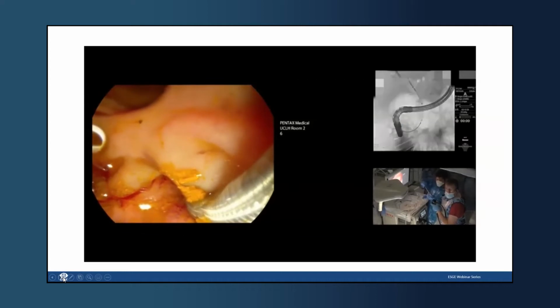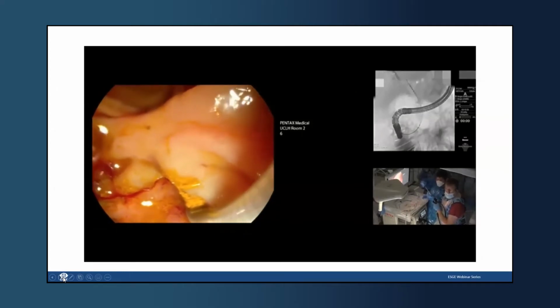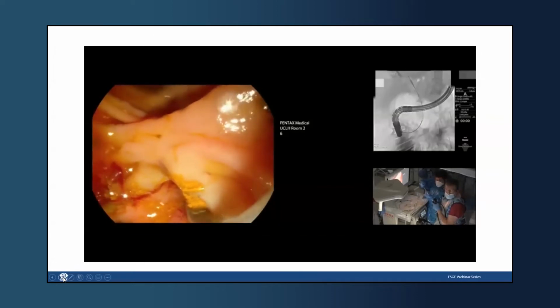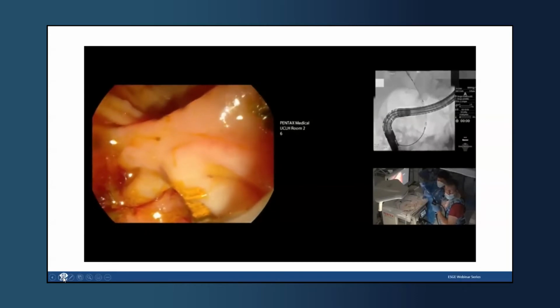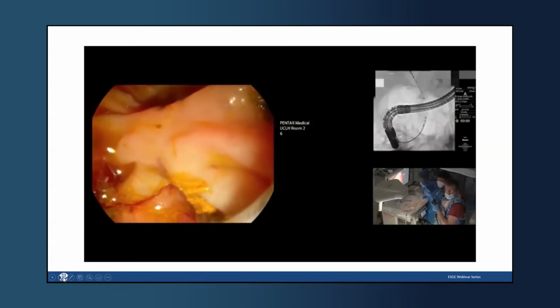Screen. So I'm just taking my bridge off a little bit, and we work together. Stop. Nice and slow. That's fine. And I want the proximal end, of course, to be below the liver hilum. So it's opening nicely there. Stop there. I think the proximal end is in a good position here. Yeah, keep deploying. Yep. Stop. I think we're pretty good here.